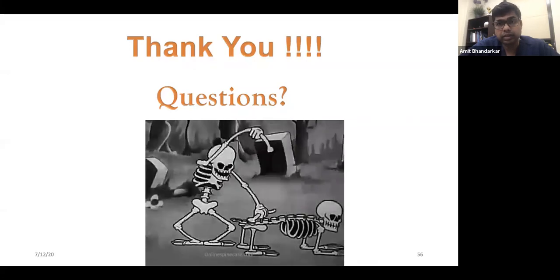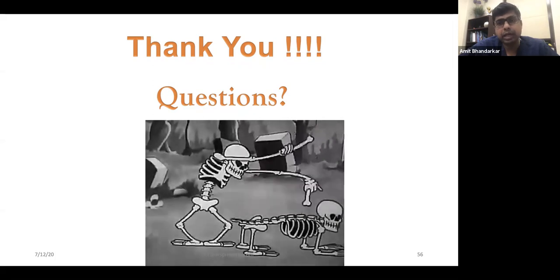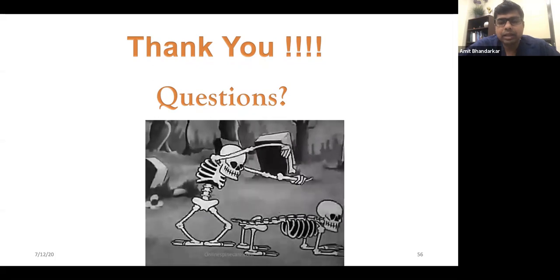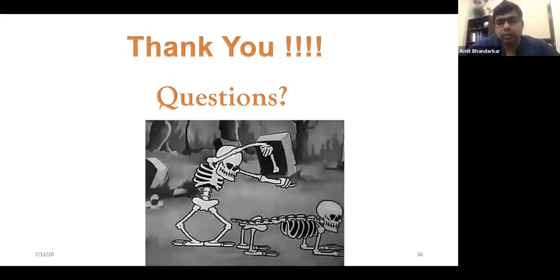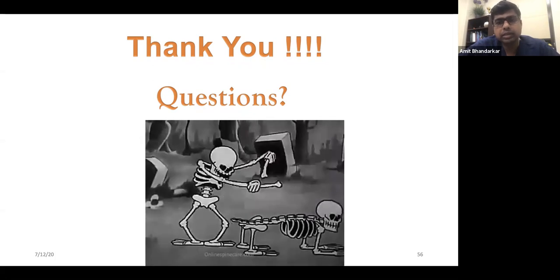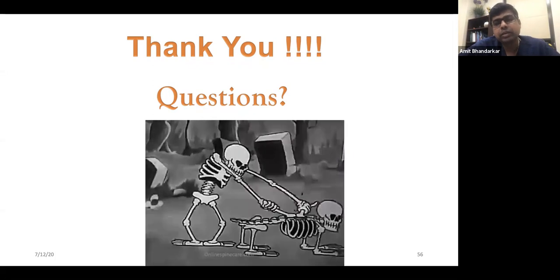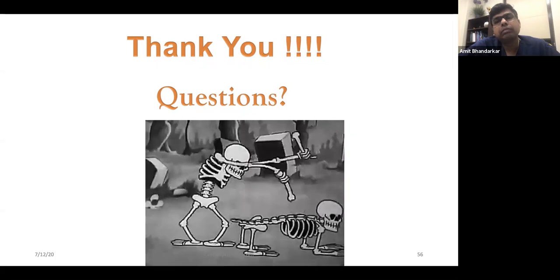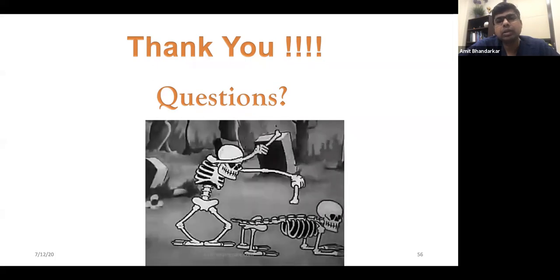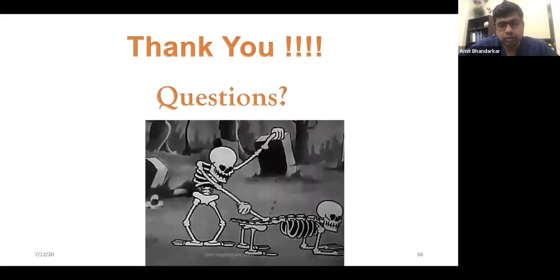There is also a lot of other stuff which is coming up. They say porous PEEK absorbs the water, like it is kind of hydrophilic. But there are still a lot of animal papers which show that it does cause biofilm. It's still hydrophobic. It's not biocompatible. It doesn't fuse where the PEEK cage is, but fuses around it. So it's very important to keep that in mind. I think it also has lesser durability or strength than the titanium. I think titanium is going to win this race.